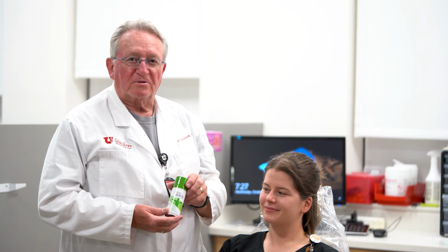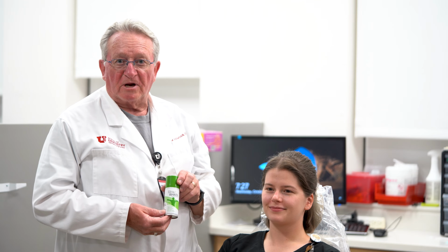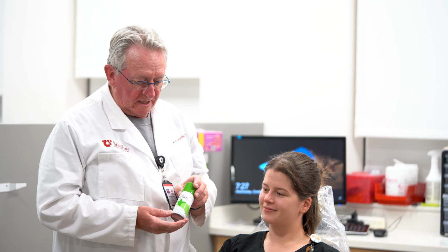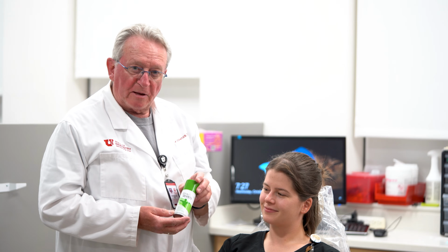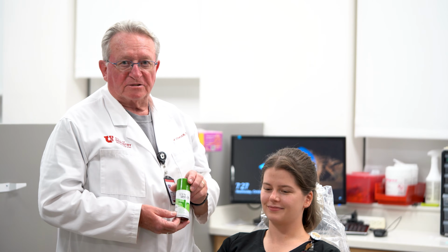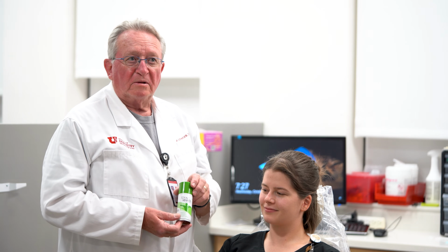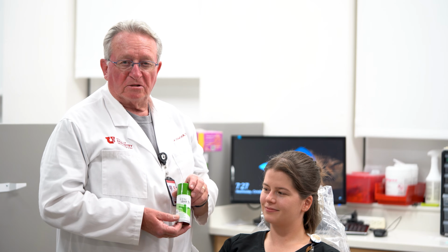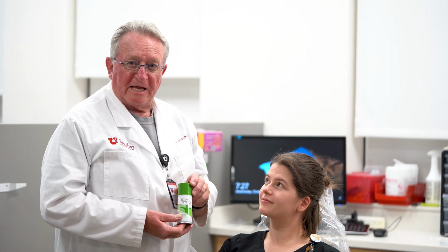Today I want to demonstrate the use of a material called Spray and Stretch. It's actually the brand name. It's made by Gebauer Company, and it's a vapor coolant spray that can be used in a dental setting primarily for diagnosis to determine how much muscle involvement is the source of pain.